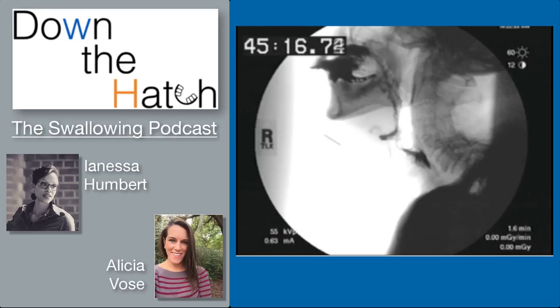The first thing I noticed was limited upper esophageal sphincter opening resulting in quite a bit of residue in the piriform sinuses. Looking at this swallow globally, this person definitely has a swallow efficiency issue. It's in the second and third time that I watch it that I'm really trying to understand how the structures are connected to get at what the major problem is — and sometimes it can be the tongue, which wasn't where my eye was fixated at first.